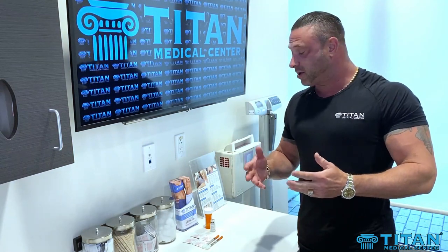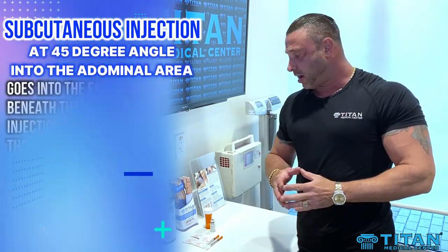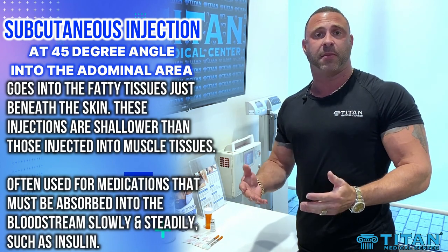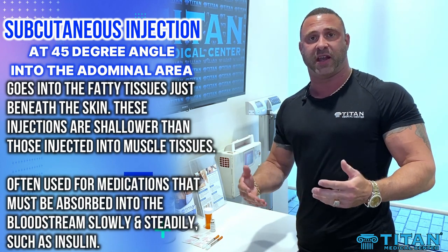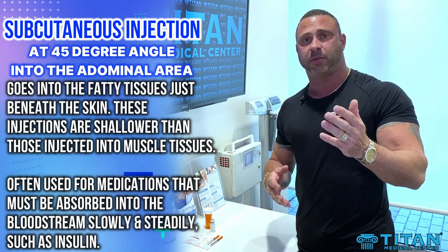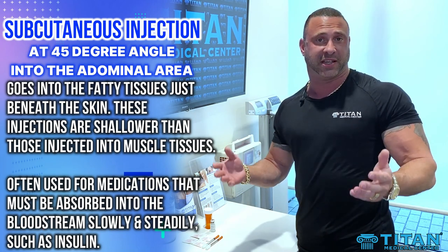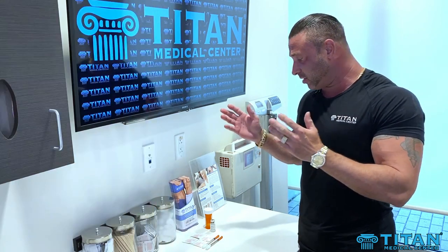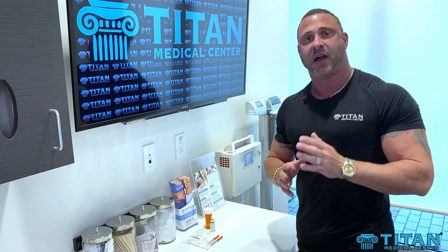Hello guys, today I want to cover subcutaneous injections. When you get your TRT medical therapies, some of the medication says to inject subcutaneously. So you might not know what subcutaneous means or how to inject subcutaneously. I thought I'd do this nice little example and go through it step by step with you guys so you fully understand how to do your subcutaneous injection.